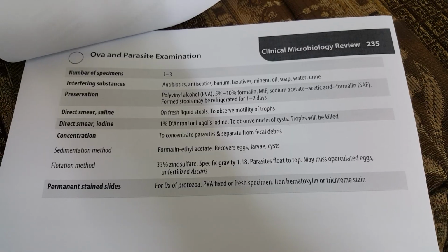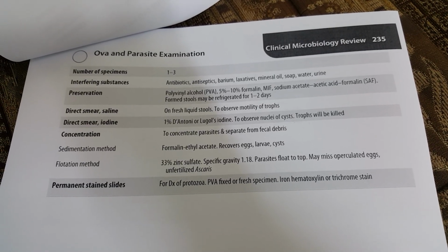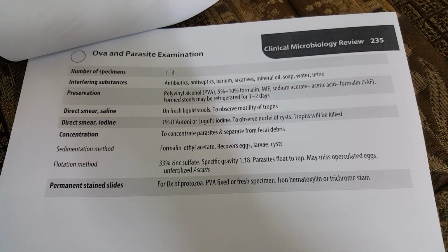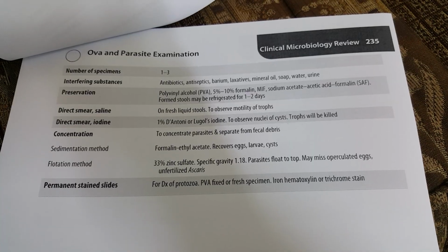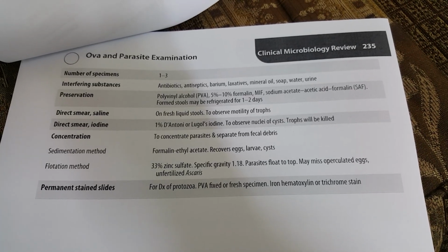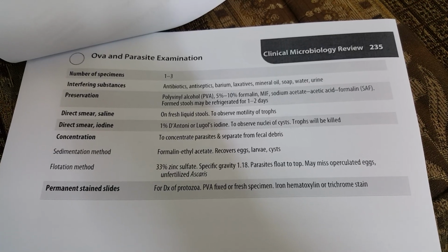The sedimentation method uses formalin ethyl acetate, which recovers the eggs, larvae and cyst forms. The flotation method uses 33% zinc sulfate with a specific gravity of 1.18. Parasites float to the top and it may miss operculated eggs and unfertilized Ascaris.